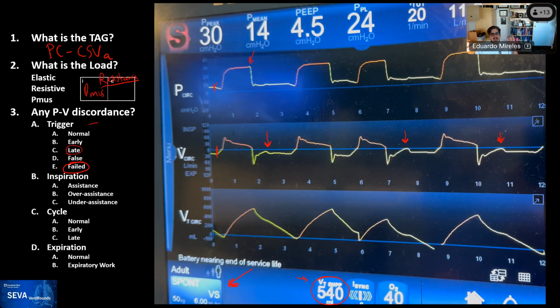Yeah, I think that mode was activated out of panic because they couldn't ventilate the patient, and they turned on every feature of the ventilator to see what's happening. I think that's why, before I started intervening, I got the video, so I wanted to share it with you and the group. Thank you for the wonderful analysis. We really enjoyed it. I love it.